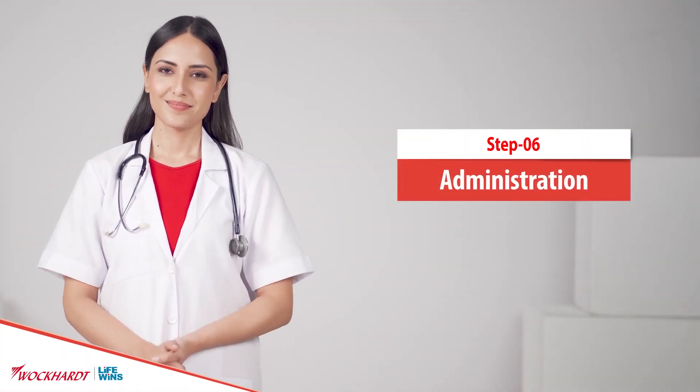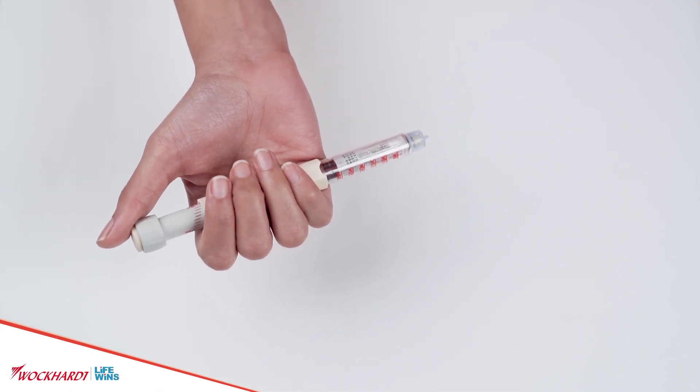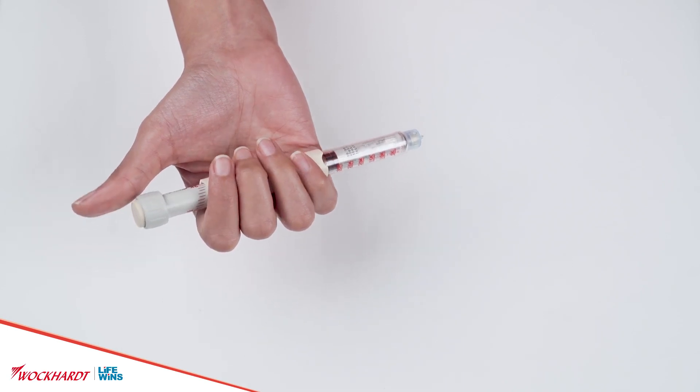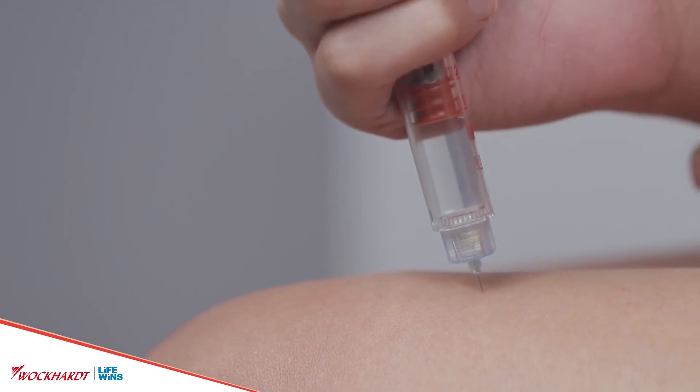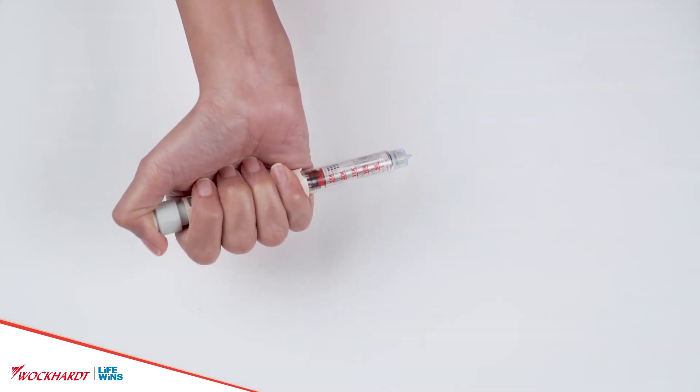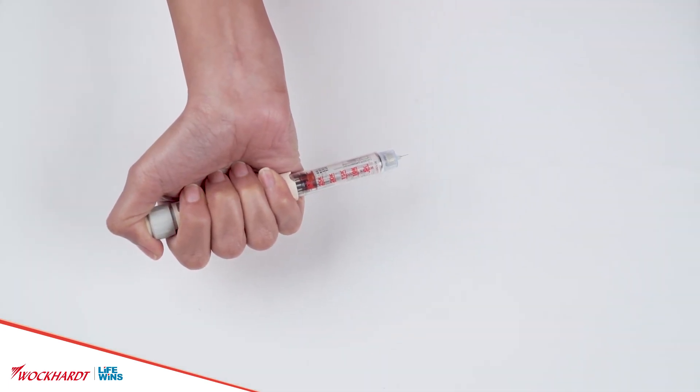Administration: curl fingers around the upper end of the Vipox Pen to hold it securely, and poise thumb above the dose knob. Gently pinch up the skin with your free hand. Quickly insert the needle at a 90-degree angle. Press the plunger completely with the thumb until the dose indicator points to zero. Continue to hold the pen firmly, count to 10, and remove the needle from the skin. Vipox Pen injection is administered through the subcutaneous route — meaning applied or injected under the skin only.